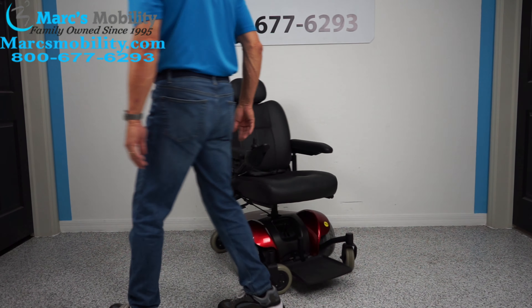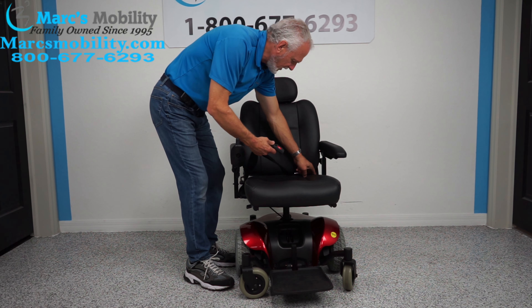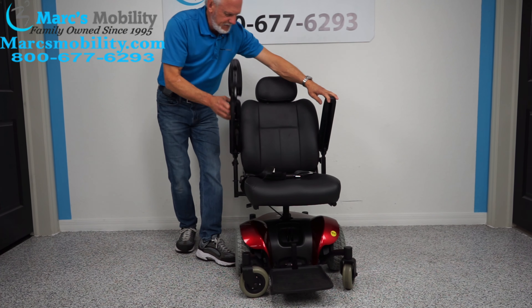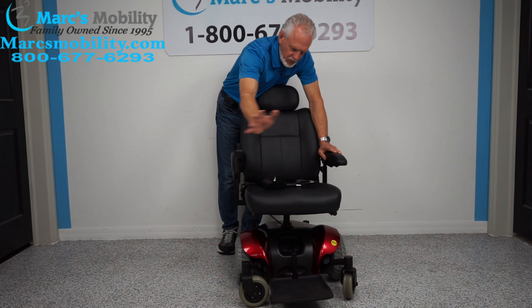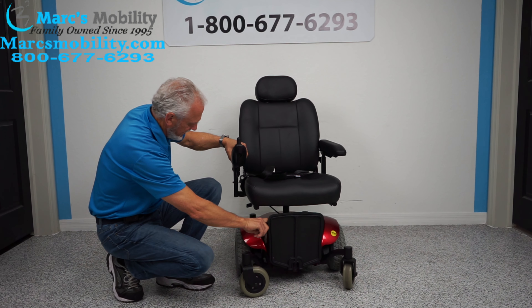The seat on this chair is 19 by 19 deep. You do have a safety belt. The arms flip up. The joystick is on the right, but if you're left-handed everything can be switched to the left side. The foot blade does flip up.